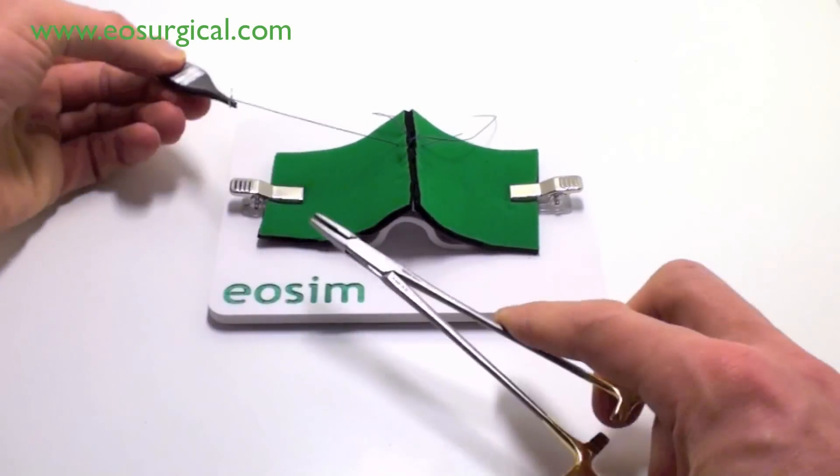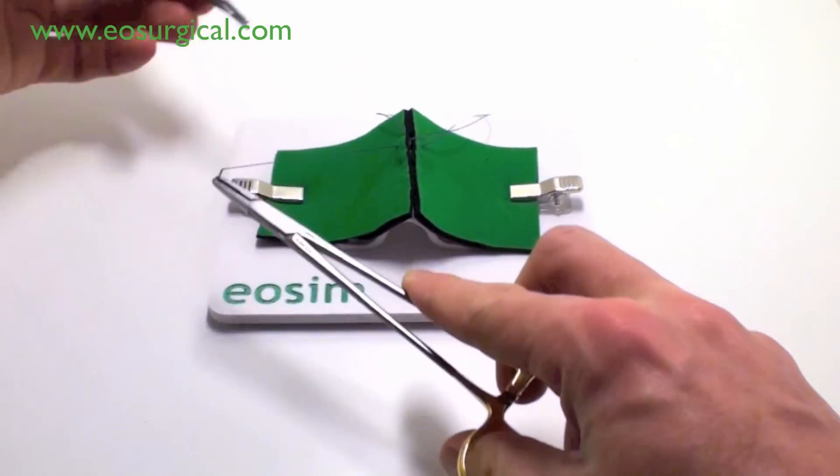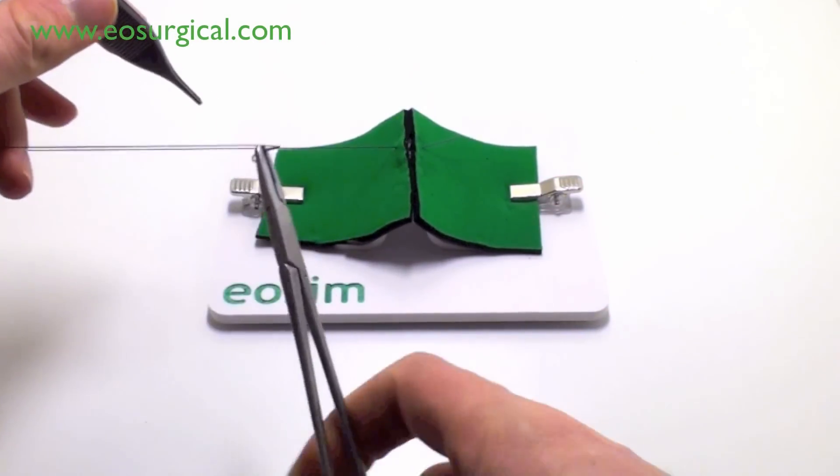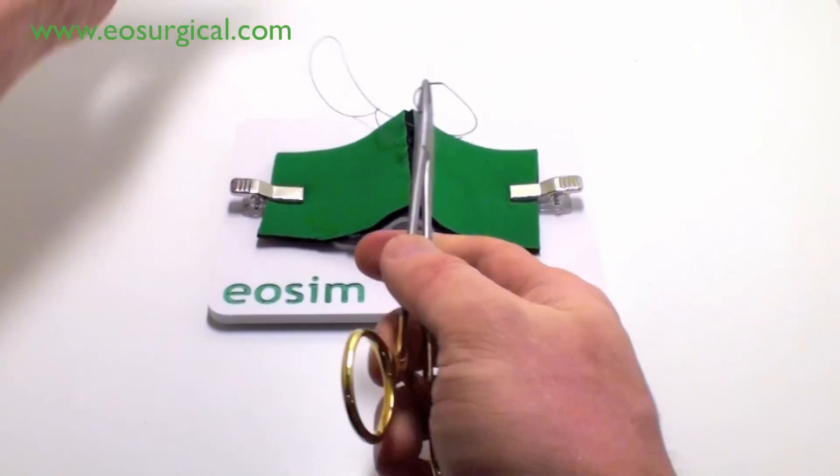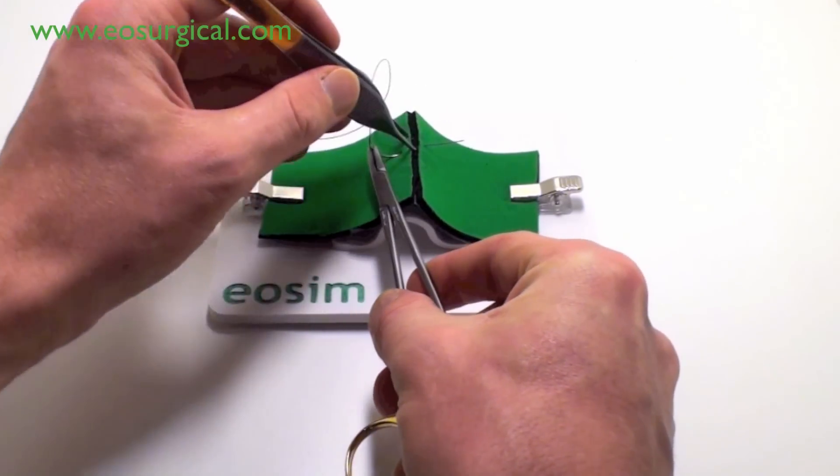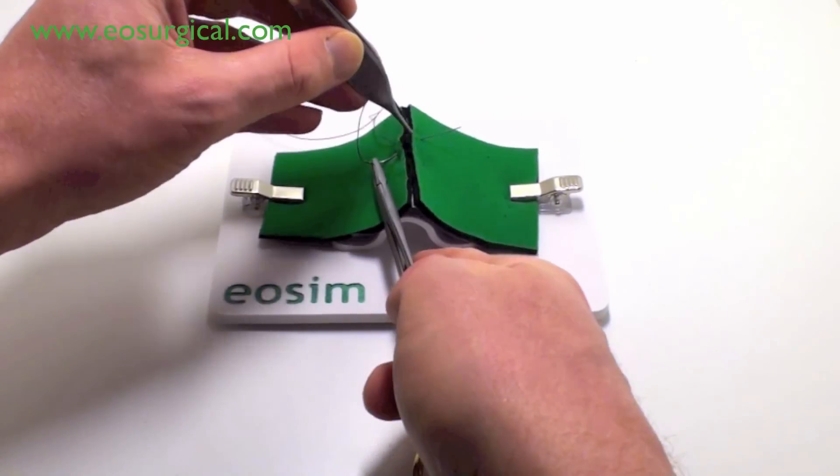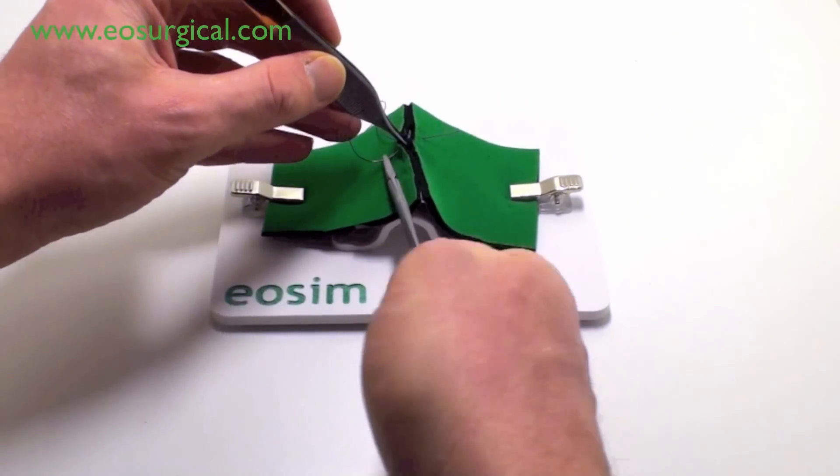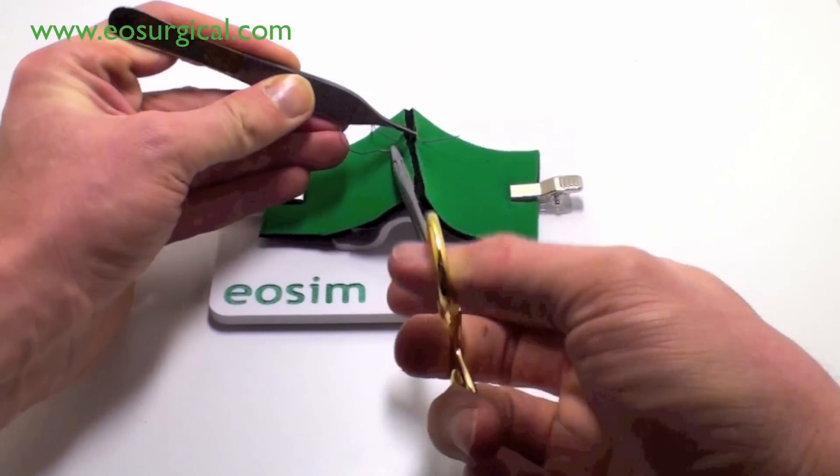Again, here. There's almost a full pronation to supination of the hand. Again, that's a maneuver to reverse the needle. It goes back through the tissues.